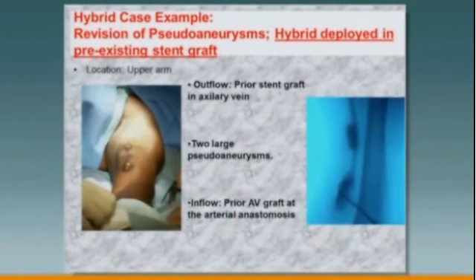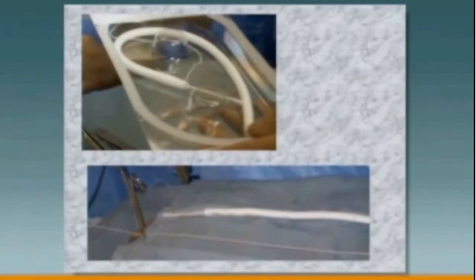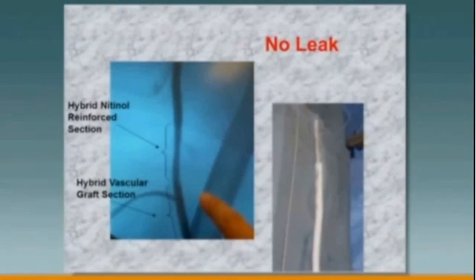Hybrid case — a revision of a pseudoaneurysm. We have impending rupture of aneurysms here, and there's actually a stent graft in the outflow. We always do our angiograms first to find out where the adequate outflow vein is, because we only have 5 centimeters of stent graft on the end of this graft to work with. You can see where an old stent graft was. The idea here is to put the stent graft into a stent graft to do a sutureless anastomosis — this is going to go inside that previous old stent. A guide wire is placed; we're going to poke the stent graft over the guide wire into the other stent. What you really have is: outflow vein, reinforced nitinol segment, and your conduit. It makes this a very simple procedure.